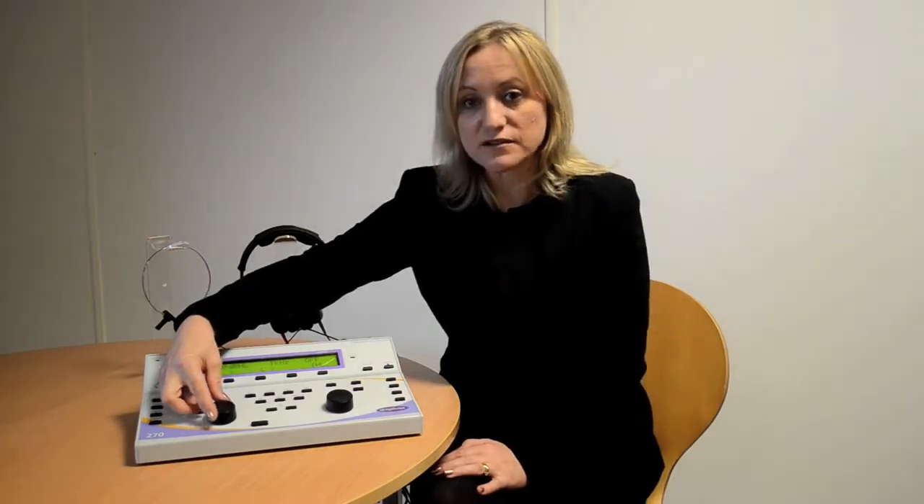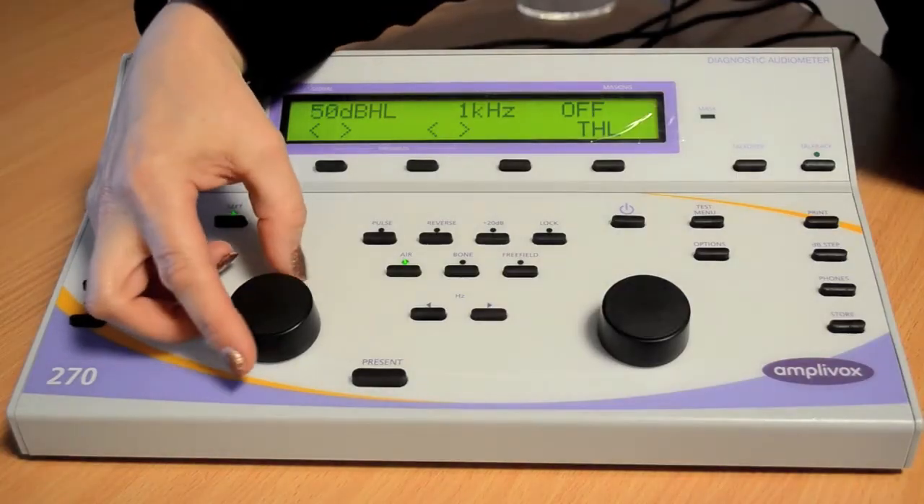To change the decibel level, use the channel 1 rotary control. To change the frequency, use the left and right arrow keys.